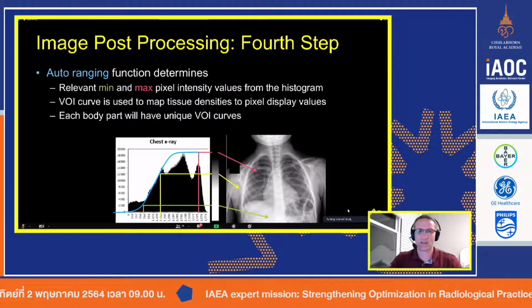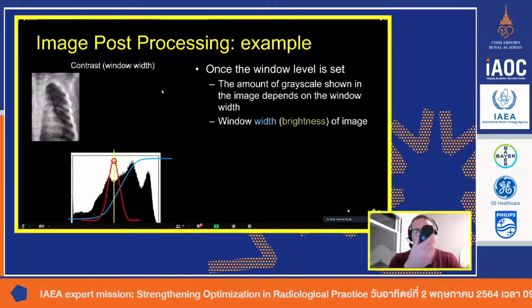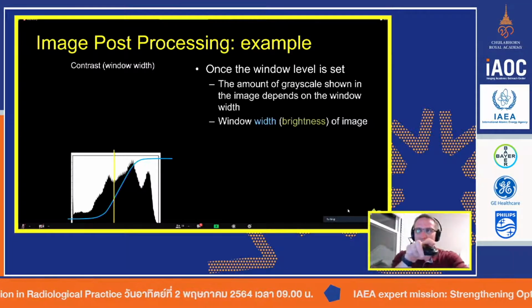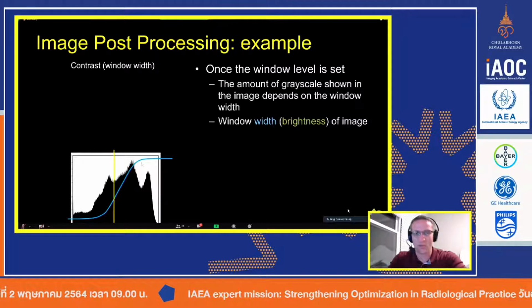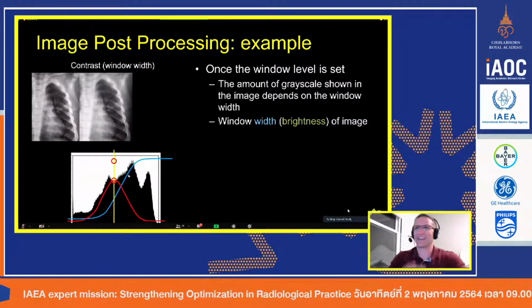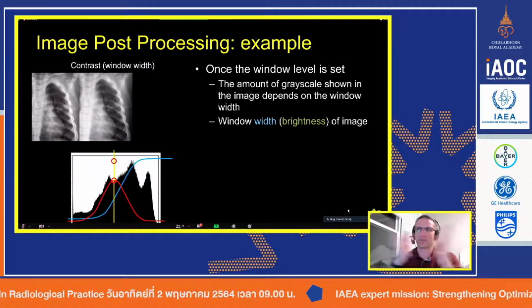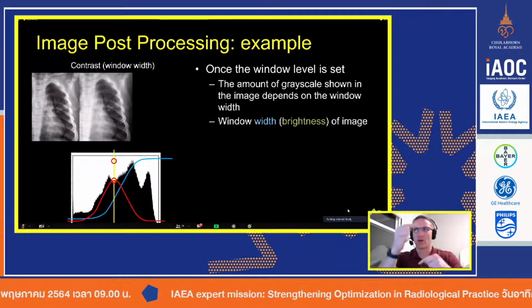And as I mentioned, when you are setting your windows and levels, when the radiologist is using their mouse, that is when it will be the most evident. The radiologist is trying to window and level, but because they didn't collimate, the system did not use the right curve. So you're going up and down and left and right, and it's not getting blacker and whiter. It's just not looking right. That is why it's very important to take the time to do the right kV, the right mA, get the right patient setup, get the right angle. All of those are very important, but also collimation.